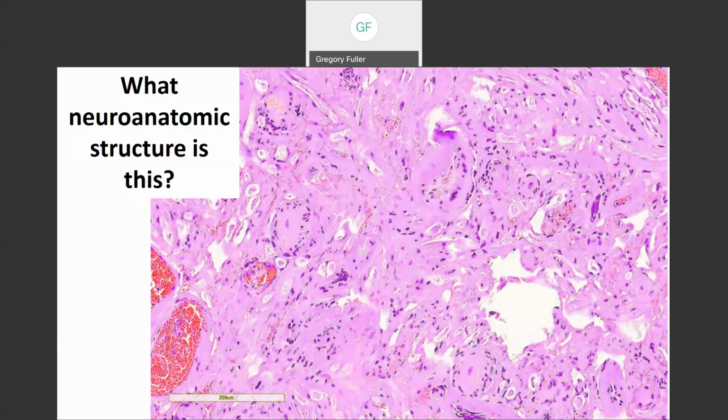Now, what was the other feature? One of the features was, let's count them. 1, 2, 3, 4, 5, see them down here, 6. Okay, come on, 6 ganglion cells and you couldn't get this? I'm being mean. All right, look at this. Look, what are these things? Look over here. See just to the right and lower right of the legend. What are all those spaces with the distorted circles? They should be perfectly round. They're a little bit oval.